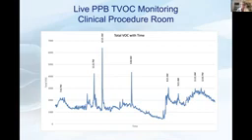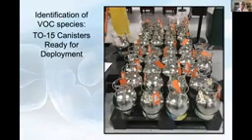And then look at what time, during which days, we are having spikes of total VOCs, and correlate that with whatever activities were happening at that time. That can help you teach, train, and adjust your own SOPs. But these are going to identify your total VOCs. The next step, if there's an interest to identify which VOCs these are, what species and what concentration, is when you want to deploy the TO-15 canisters and do some of that air testing to really identify whether these are problem VOCs. And once you know which VOCs, you can typically identify the source and try to remove that source.